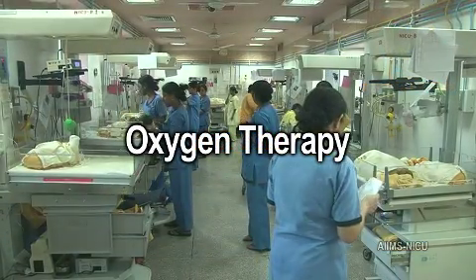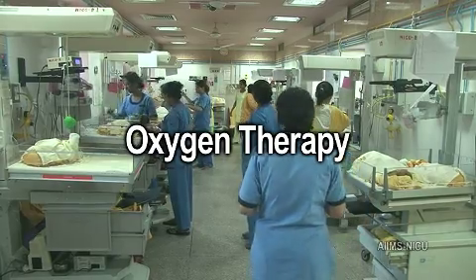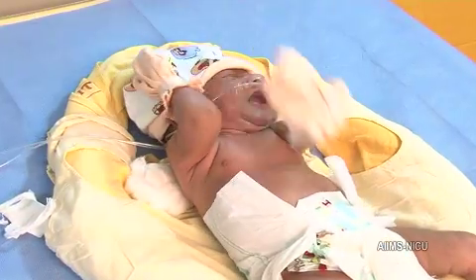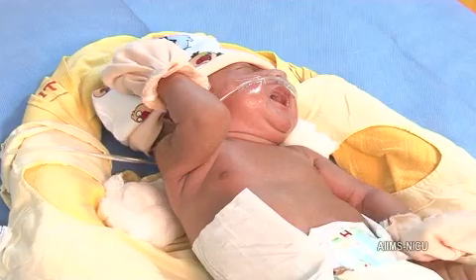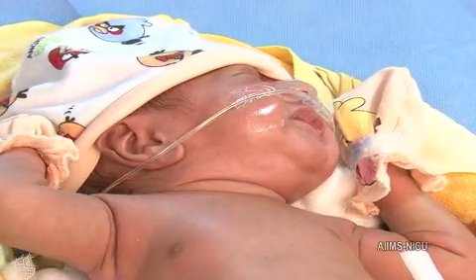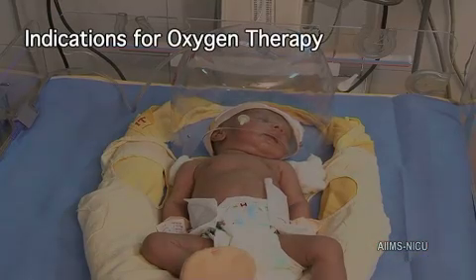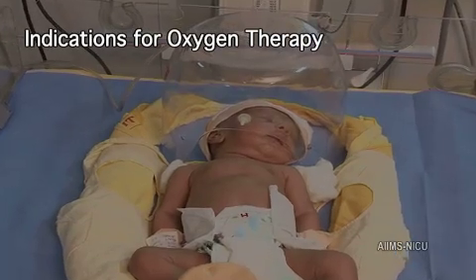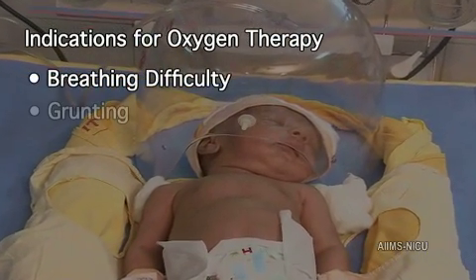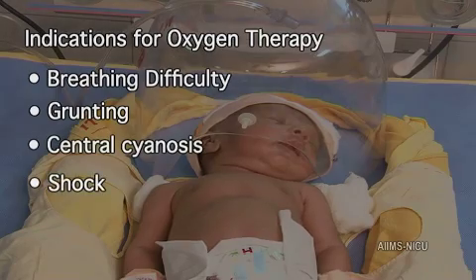In this video, we shall learn about the oxygen therapy by hood and by nasal cannula. Administering oxygen to sick neonates helps to relieve hypoxia, thus improving the oxygen supply to the tissues. Oxygen therapy is indicated in babies with breathing difficulty, with grunting, with central cyanosis, or with shock.